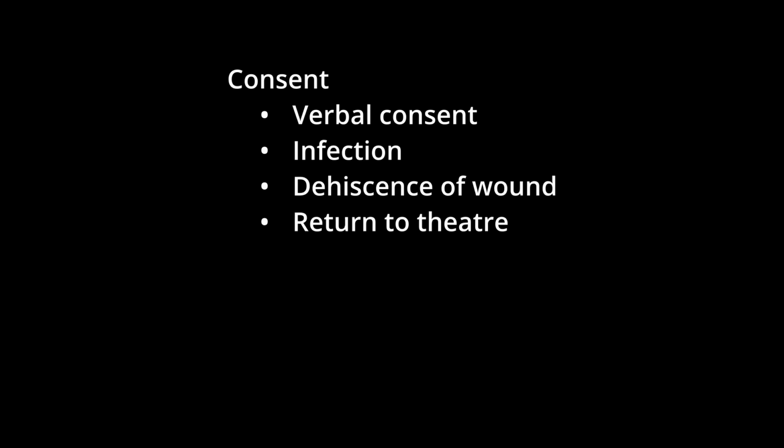Before removing any corneal suture, explain clearly to the patient what you are going to do. Reassure them that it should not cause significant pain, but that they must look exactly where you ask them to look and keep as still as possible. You should verbally consent for the small risk of infection, although you can, of course, state that the removal of the suture reduces the long-term risk of infection. For post-trauma and penetrating keratoplasty, you should consent for dehiscence of the wound and a need to return to theatre that day to put a further suture in.